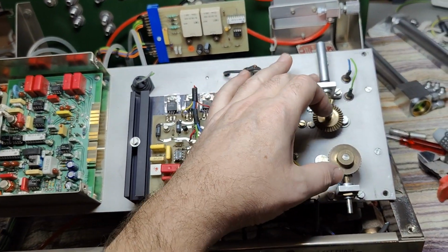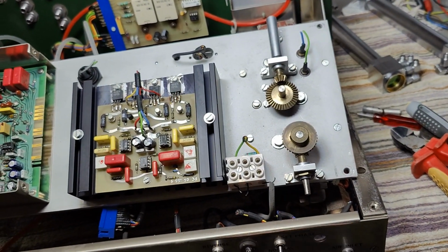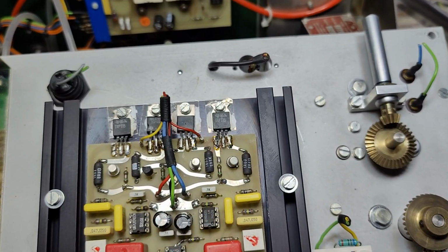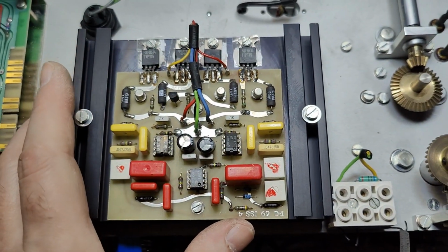So this is the bottom plate of the main sensor unit. Here we got the mechanical adjustments. I'm gonna go and dig into what exactly it is they're doing, because I haven't yet figured that out. That's just some power supplies, nothing fancy here, just some op amps and some power transistors. So yes, this is definitely just a linear power supply.